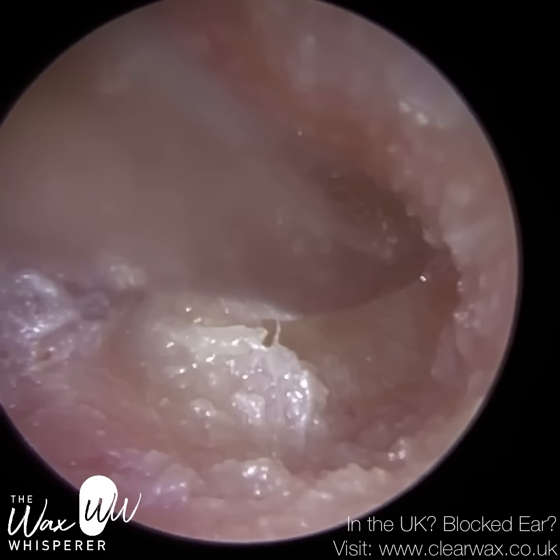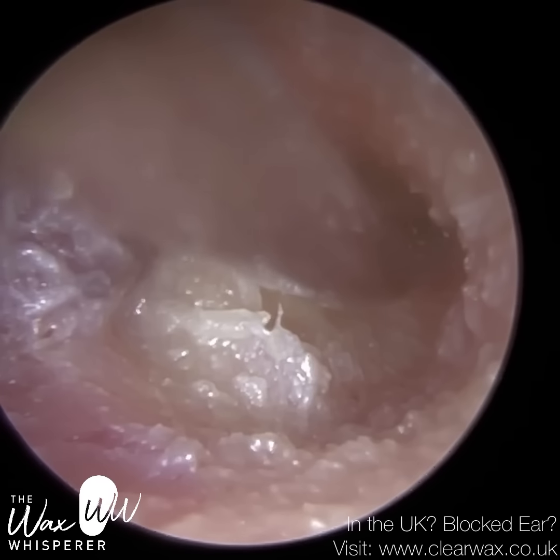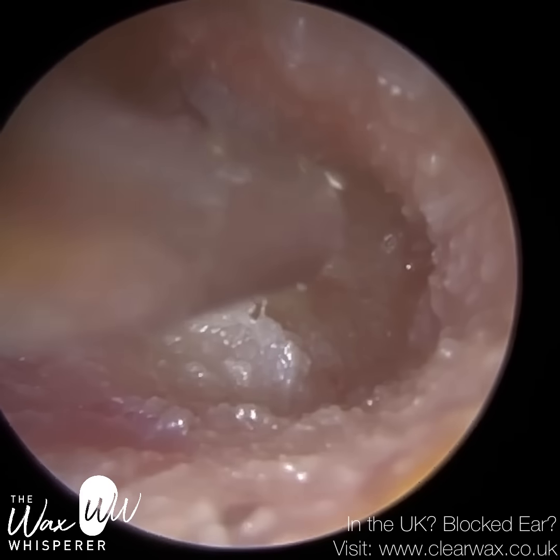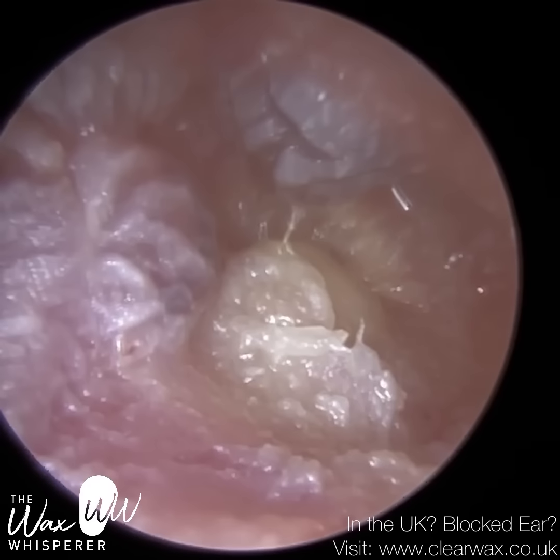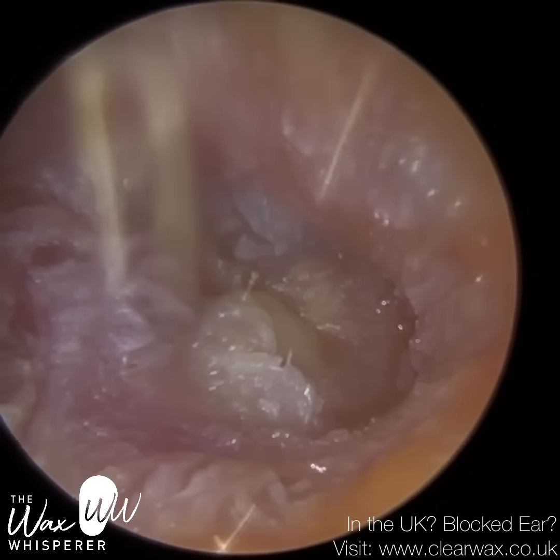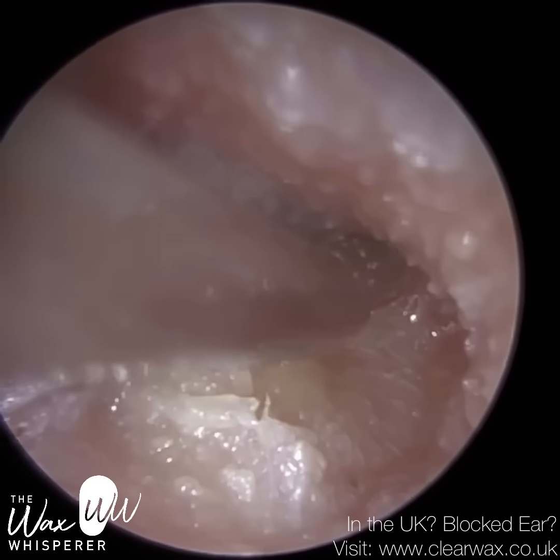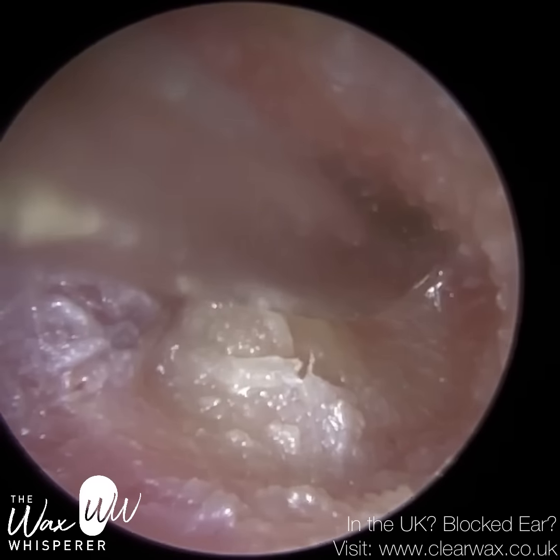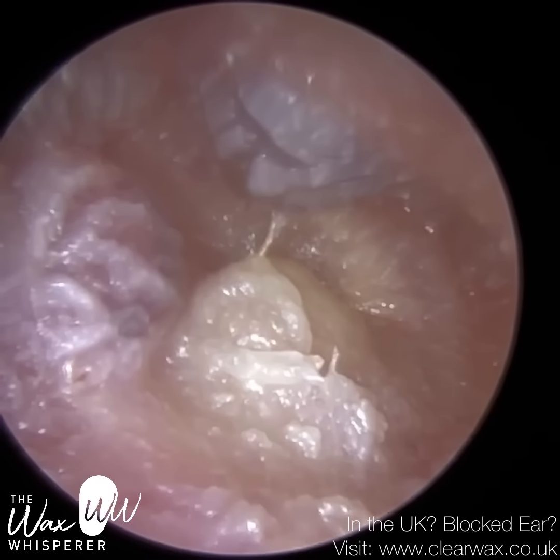Now, it's possible that maybe this eardrum was already perforated and all the discharge from the middle ear entered into the ear canal, and it was only a small perforation, and that perforation has since healed, and again you've got another collection of fluid. It's difficult to tell, but I suspect they've actually got two infections. And they're separate. They've got otitis externa, which is an outer infection, as I explained, and we'll call it acute otitis externa because there's inflammation and swelling and discharge. You can get superficial otitis externa, and that's when patients have a bit of dry, flaky skin.